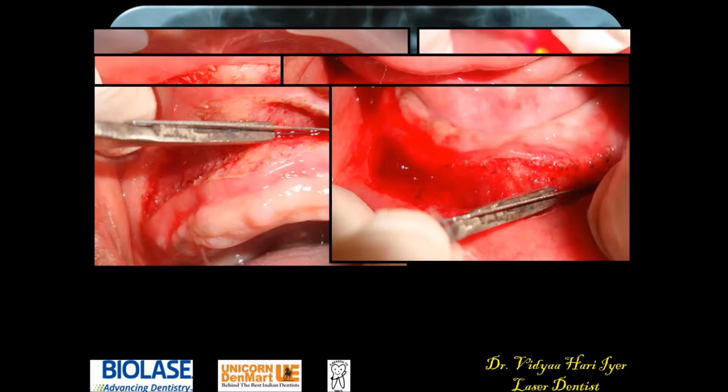And this is a very advantage because what happens is we get a very good understanding of the gums, and we are able to give a much better retention for the patient. So this is very important, and I would encourage you all to understand that this is going to give a very good retention for the patient, and that is very, very important.